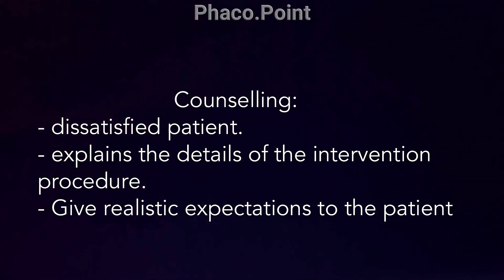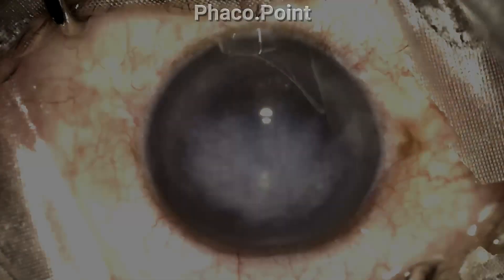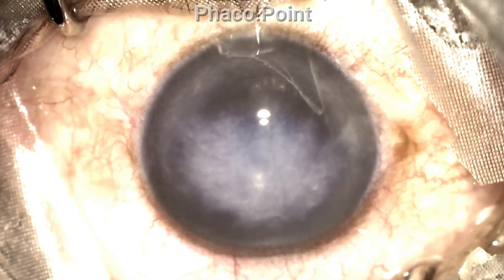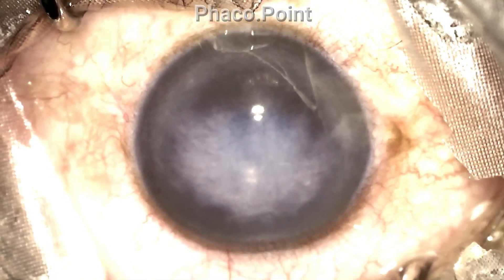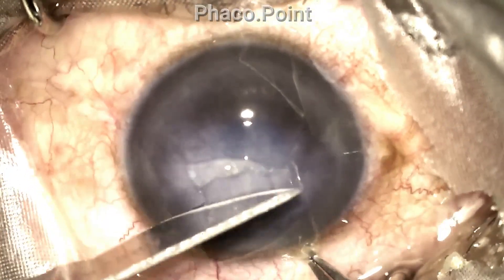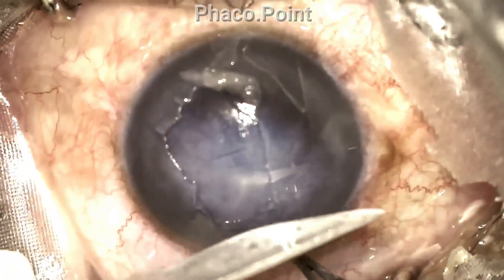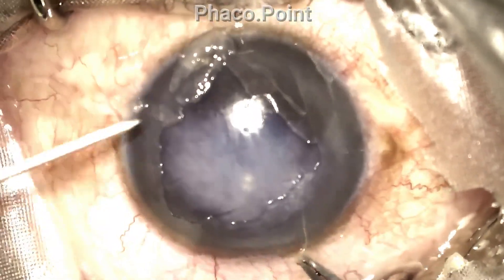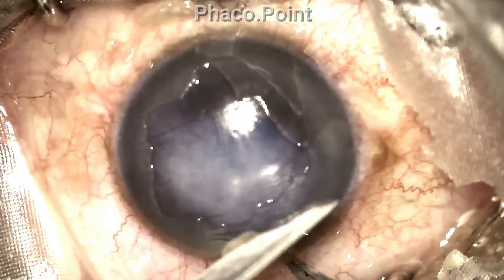Here's the patient with a rather dense corneal opacification from a long-standing Descemet's detachment. At the outset, I think it's extremely important to remove the corneal epithelium, as this gives you such good visibility during the Descemet's pexy procedure.